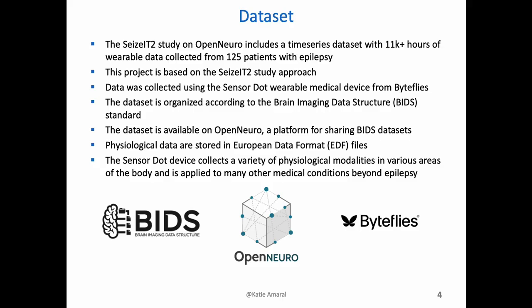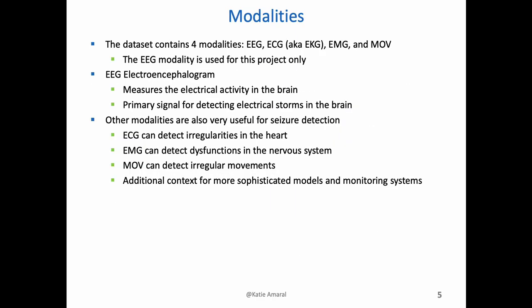This project is based on the SeizeIT2 study, which includes a time series dataset collected with a sensor-wearable medical device from a company called Byteflies. The full dataset contains over 11,000 hours of wearable data for 125 patients with epilepsy. The physiological data are stored in binary files in the European Data Format, which are readable using the PyEDFlib Python library. The dataset is organized according to the Brain Imaging Data Structure standard. The dataset is available to download on OpenNeuro, a platform for sharing BIDS data.